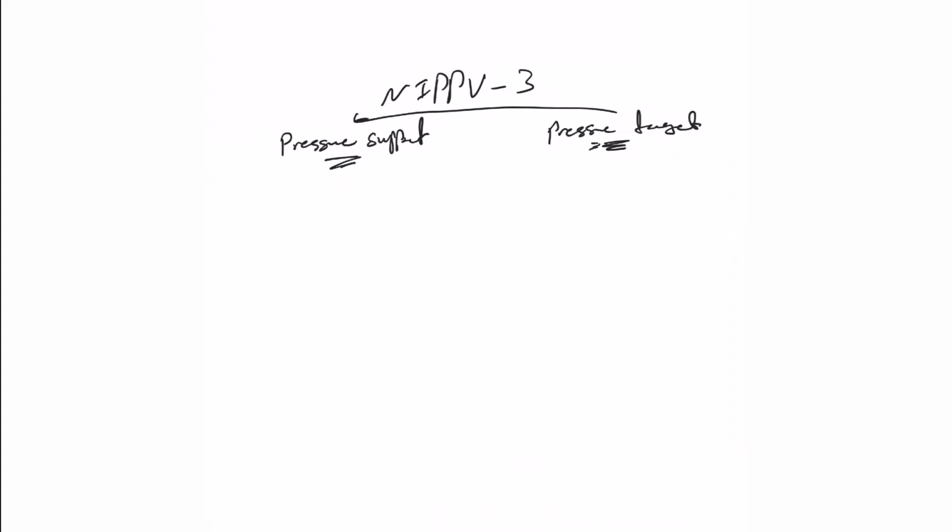Let me make it easy. So we have pressure depicted against time, and we see this baseline, let's say A. This represents the CPAP or PEEP or EPAP, the same. This is a baseline during inspiration and during expiration.